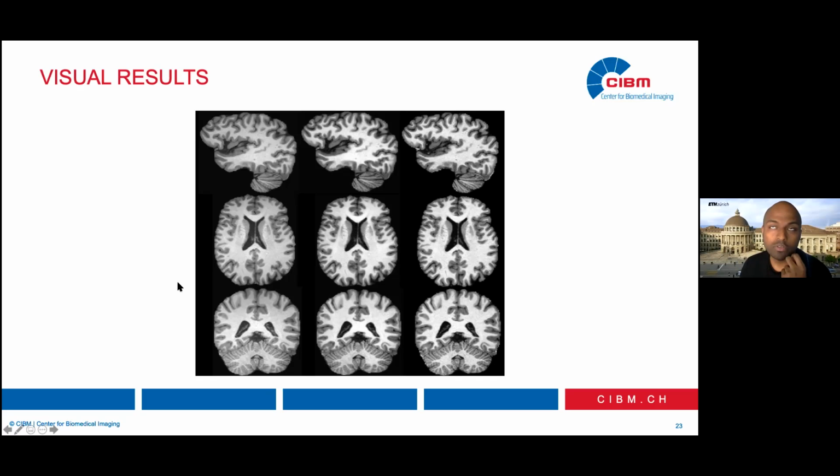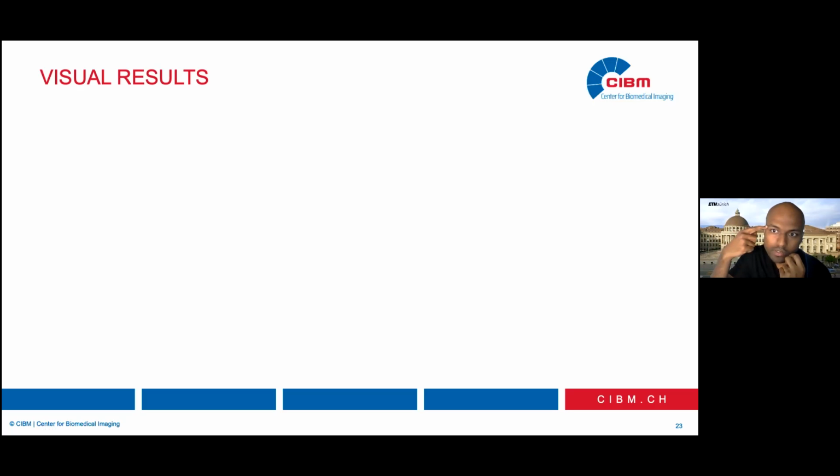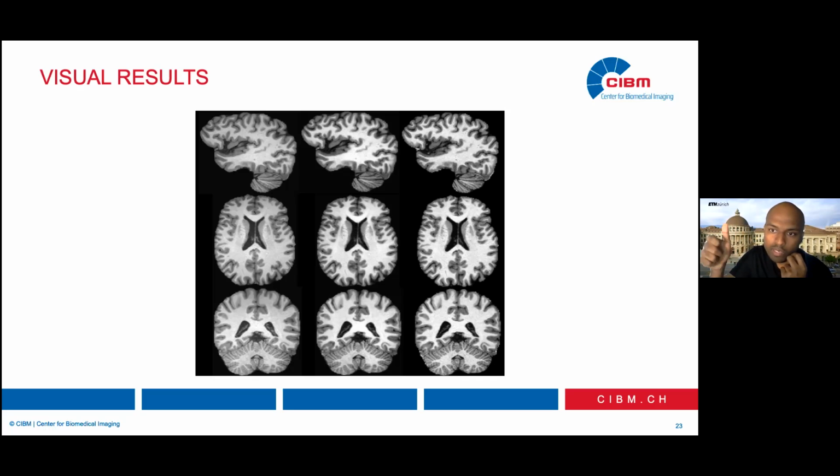And a follow-up question on this: you have a fairly deep image-to-image translation network, which produces the residual between the two contrasts. Even though the network is quite deep, you basically model only contrast changes. You don't end up introducing any structures in the translated image? Yeah. The reason for this is the L1 loss. The goal is really just to make the network learn the mapping between the two. In this sense, the L1 loss was probably the most obvious choice.